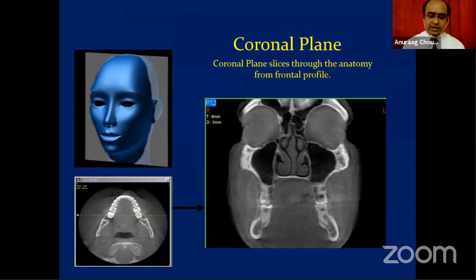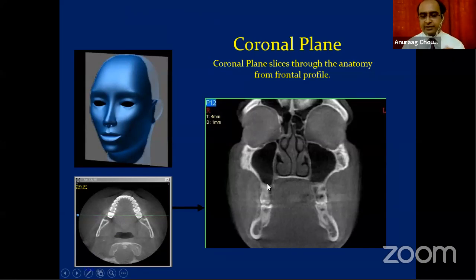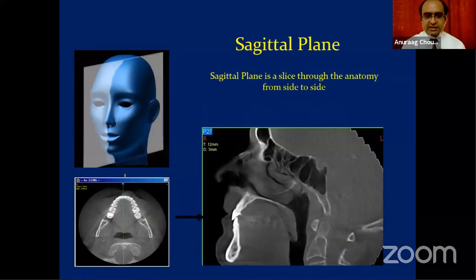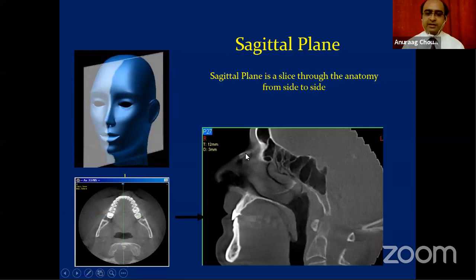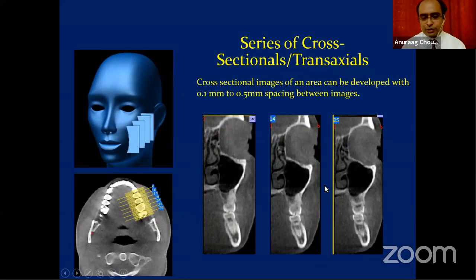The coronal section represents the frontal profile of the patient — you can see the orbit, sinus, nasal septum, turbinates, nasal cavity, floor of nose, palate, maxillary teeth, and mandible. The sagittal section is the lateral profile, where you can see the maxillary sinuses, frontal sinus, nasal septum, nasal bone, palate, and anterior teeth. MPR is called multi-planar reconstruction because it includes axial, sagittal, and coronal sections in the same image.